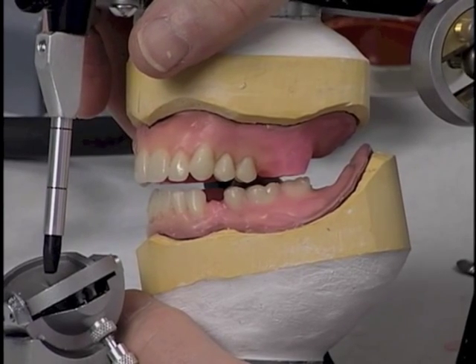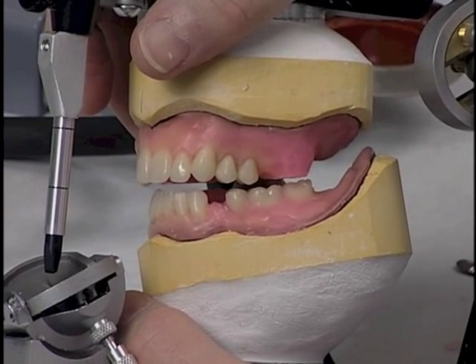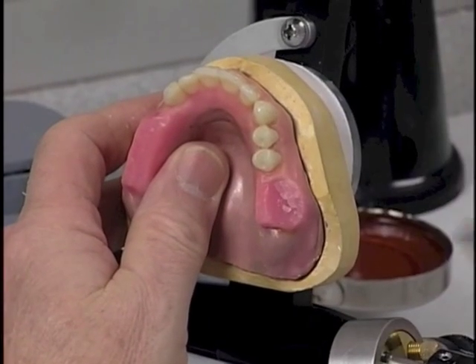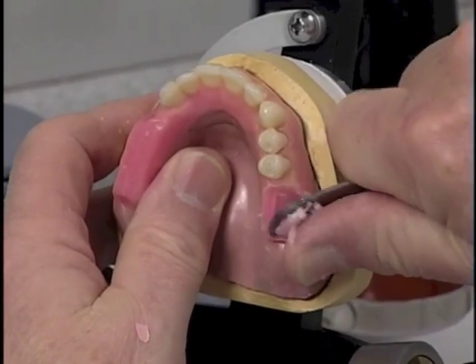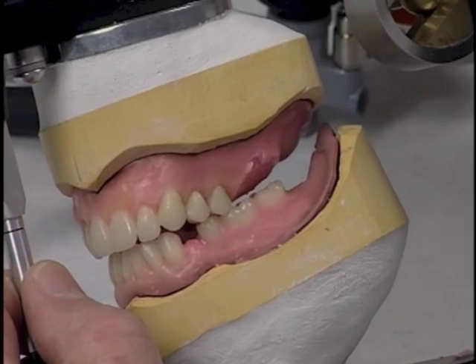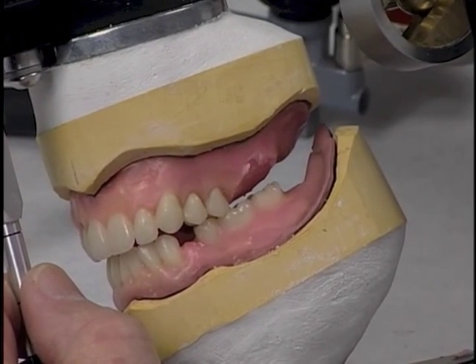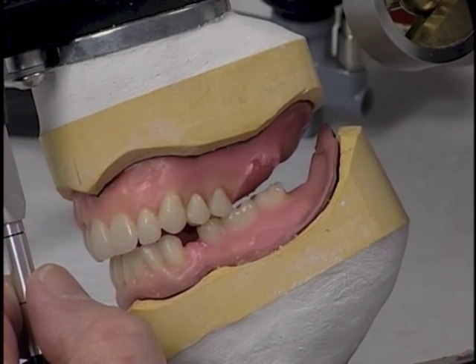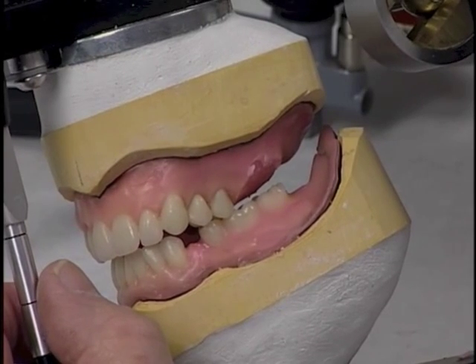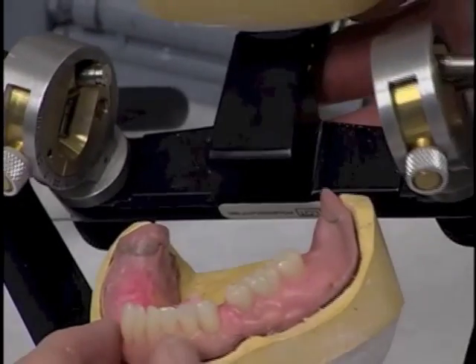Now that the mandibular molars are in place, we're ready at this point to remove wax in the area where we would like our maxillary molars to be arranged. We're going to place the maxillary first molar in such a position that it meets Angle's classification 1 of occlusion, meaning that the mesiobuccal cusp of a maxillary first molar should align with the buccal groove of the mandibular first molar.